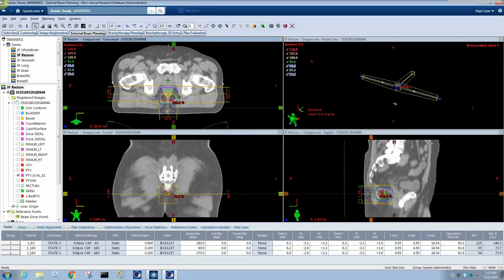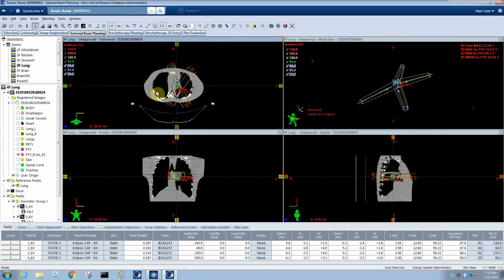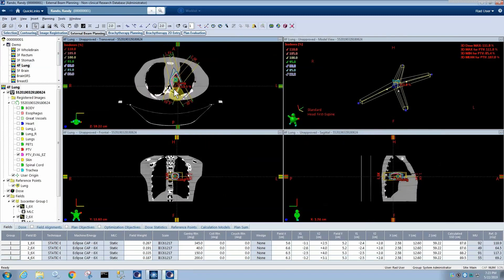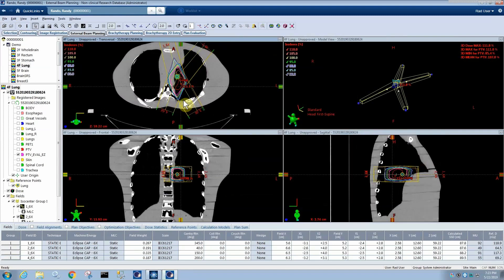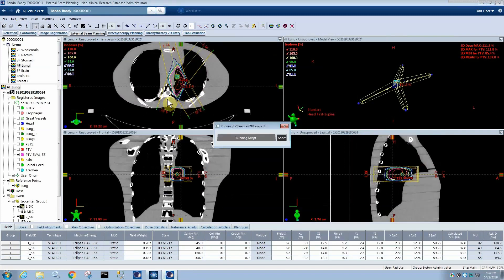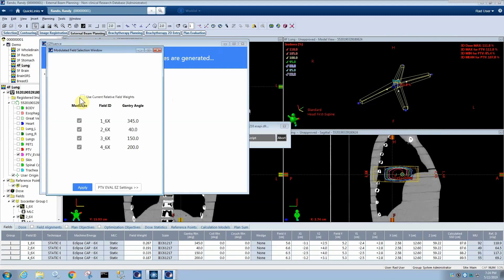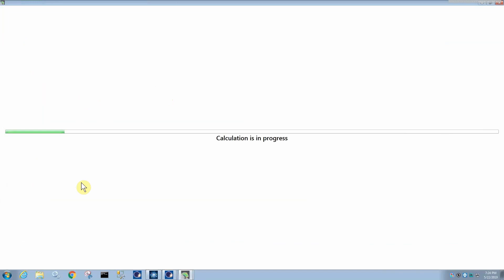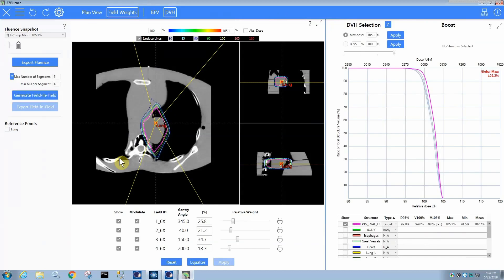Now for another example, I'm going to do a four-field lung. So in this case, we have four fields coming from these kind of oblique gantry angles. I want to use this plan to demonstrate how field weights work, the relative field weights. In this case, I'm going to not use the current relative field weights and it will automatically select field weights. It basically throws out the field weights that you had in Eclipse and it just automatically optimizes them to what it thinks makes the most sense. So here we have our result, so these relative field weights were chosen by the optimizer.